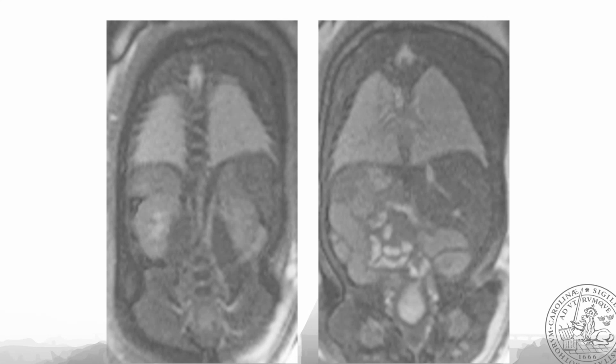So in our center, we have the pediatric radiologist looking at the entire fetus except for the brain. But it is the pediatric radiologist screening for brain abnormalities, and then the neuroradiologist is asked if there are any particulars to discuss. And as we've heard already, this seems to be quite different in different centers.